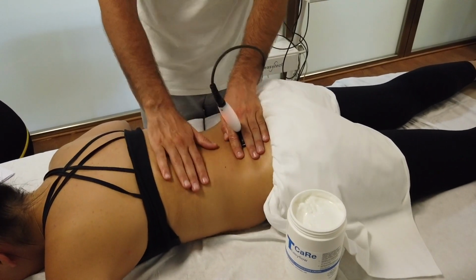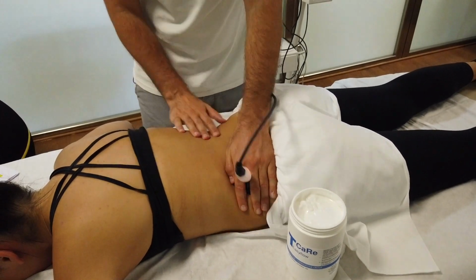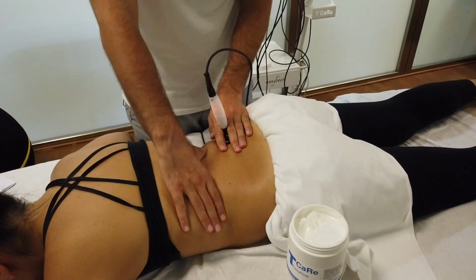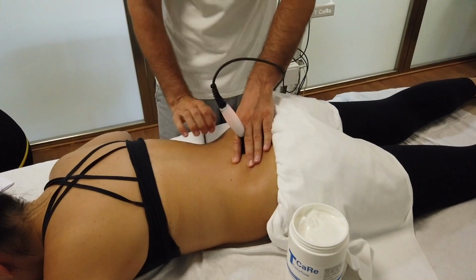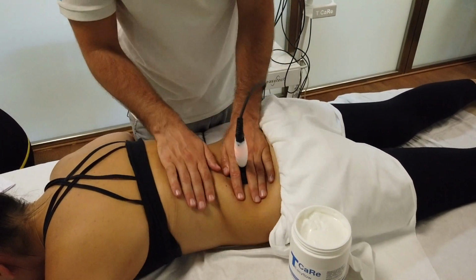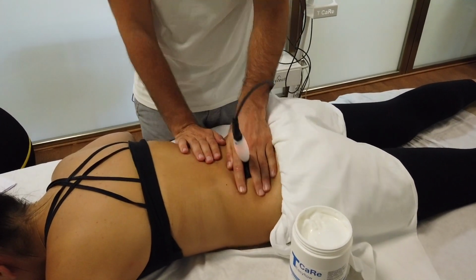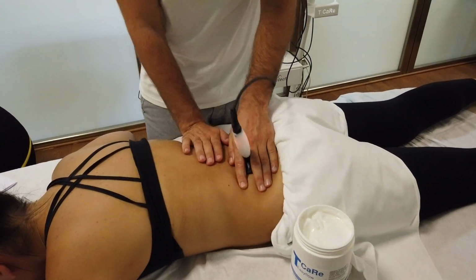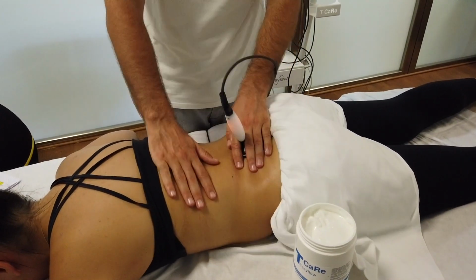It's very useful before, for example, manipulation therapy, because I decrease the contraction of the muscles, so manipulation is comfortable for the patient, and I can perform the manipulation without pain and in a very easy position.